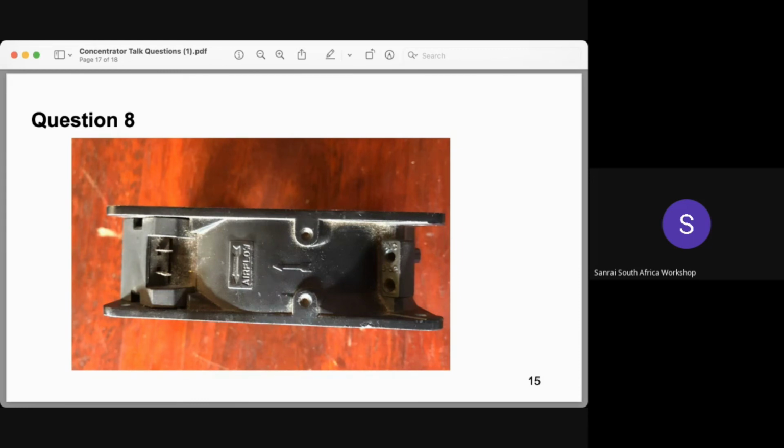So to fix the above stated problem, you would have to now check how you've placed the fan inside of the concentrator when you're installing it. Check if the orientation is correct, and also check the power rating of that fan. If the orientation and the power rating are correct, then you would also need to look at some of the parts that could cause overheating in the machine, which could be the compressor itself that is overheating, the thermistor that is overheating, or also check if there are any blockages, any filter that could be causing a blockage and causing overheating in the machine. Thank you, Mwabi.